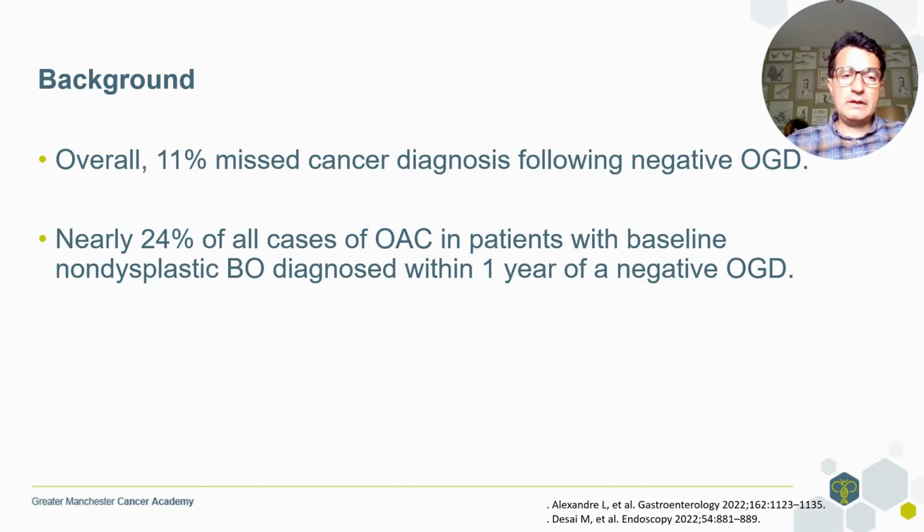Just a bit of background here. Overall, 11% of missed cancers in upper GI are diagnosed following a negative gastroscopy.